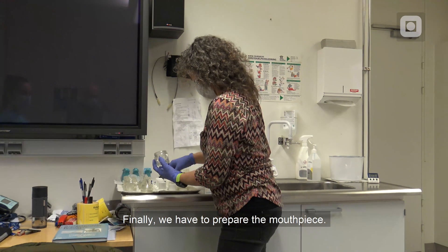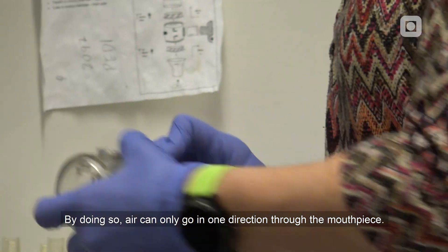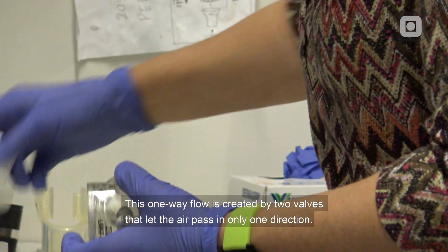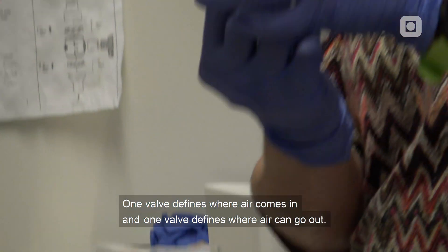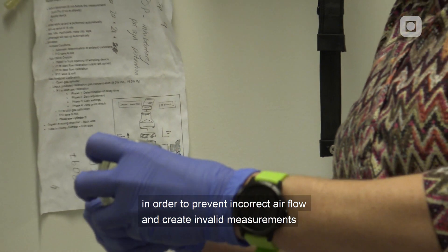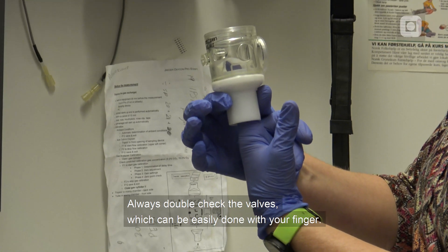Finally, we have to prepare the mouthpiece. The mouthpiece consists of 7 pieces that need to be set together in a specific order, so that air can only go in one direction through the mouthpiece. This one-way flow is created by two valves that let air pass in only one direction — one valve defines where air comes in and one valve defines where air can go out. You have to be careful that the valves are in the right place and in the right direction to prevent incorrect air flow and invalid measurements. Always double-check the valves, which can be easily done by using your fingers.